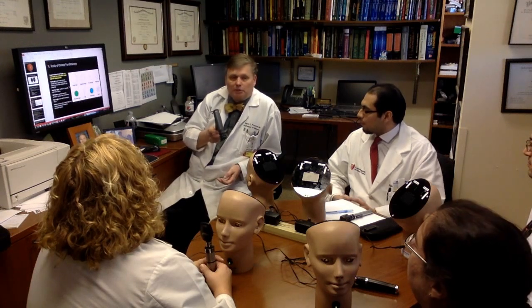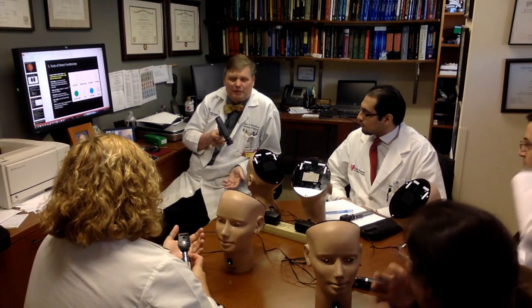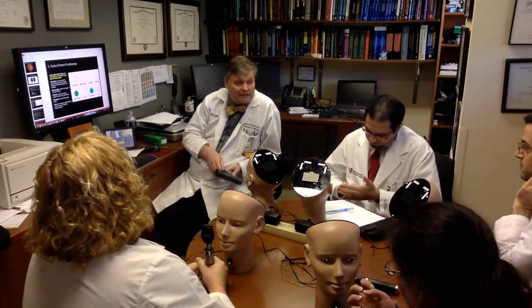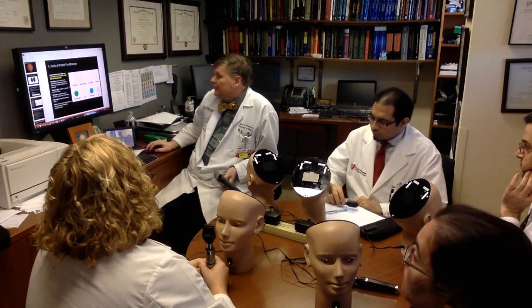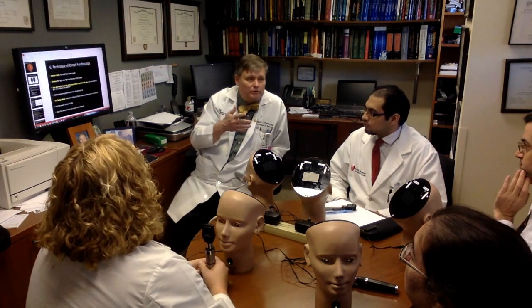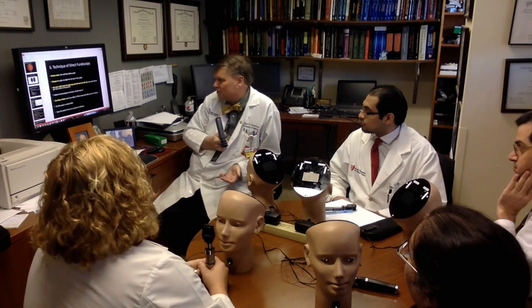Then you want to make sure your power is between 80% and 100%. Some people will say maybe not 100%, because it might be too bright and cause the pupil to constrict, okay? Now, if the eye is dilated, that's not an issue. Now, when we do this, what you want to do is darken the room. Pull the shades, turn off the light. You want to choose the right size light that we just talked about, the big circle or the small circle.